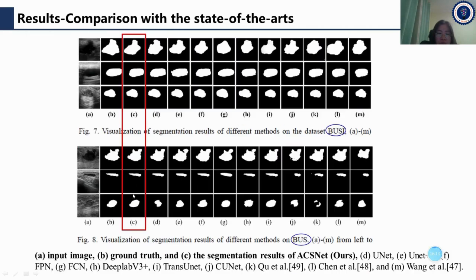Visualization results on the BUSI dataset show the original image, the ground truth, and our result — our result achieves the best segmentation.